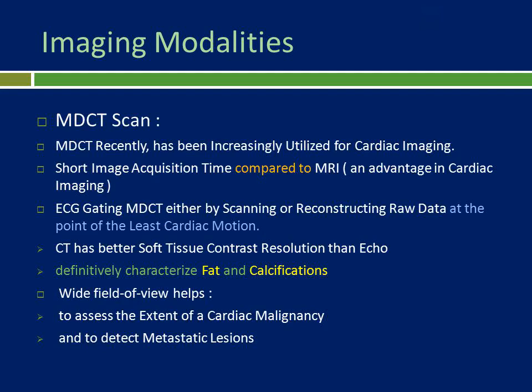Imaging modalities: MDCT scan. MDCT recently has been increasingly utilized for cardiac imaging. Short image acquisition time compared to MRI, an advantage in cardiac imaging. ECG gating MDCT, either by scanning or reconstructing raw data at the point of the least cardiac motion.